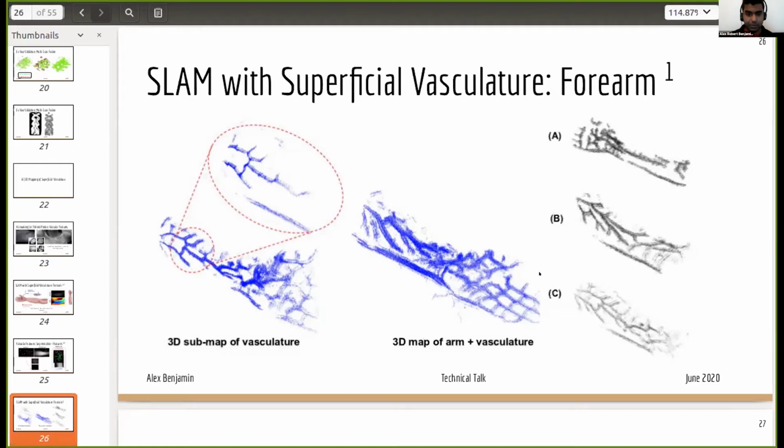to these vasculature maps. Now, in the interest of full disclosure, these maps, as they stand now, are fairly noisy. So the localization also tends to have errors. But keep in mind that the sensor that we're using on the probe, you can buy it for $100. So it's not a very high resolution camera. In the limit of using a high resolution infrared camera, you could resolve and get much, much better localizations.